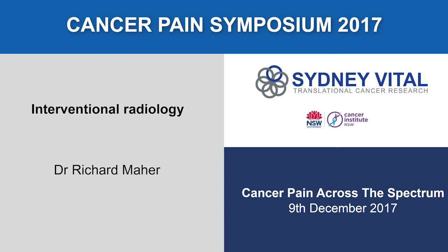Okay, so if this is obviously at risk of then causing pulmonary embolism, because that's what the next side it will go, right side of the heart and then to the lungs. So you just have to be watching that. A small amount of cement to the lungs probably causes no problem whatsoever, but obviously a large amount could cause significant problems. So, and this is just to show you the posterior vertebral cortex.